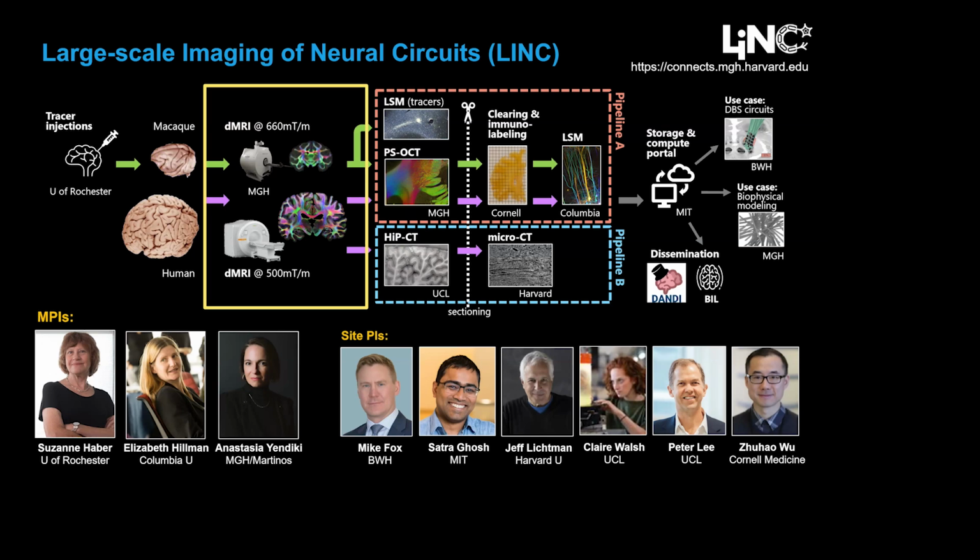She's put together this very elegant project that will allow us to probe axons in certain areas of the brain. We're focusing on the internal capsule, going down to the brain stem, using the Connectome 2 as a platform technology to do ex vivo whole brain tractography at very high spatial resolution. We have two protocols, one targeting a slightly lower spatial resolution of 0.8 millimeters for microstructure, and then a very aggressive spatial resolution of 0.4 millimeters for whole brain tractography.